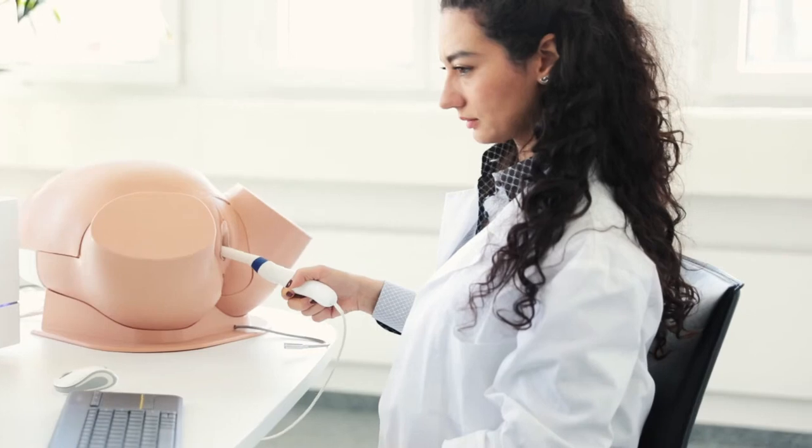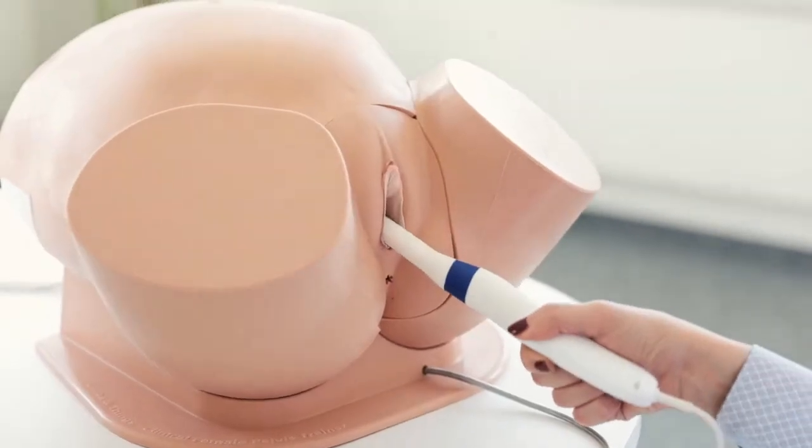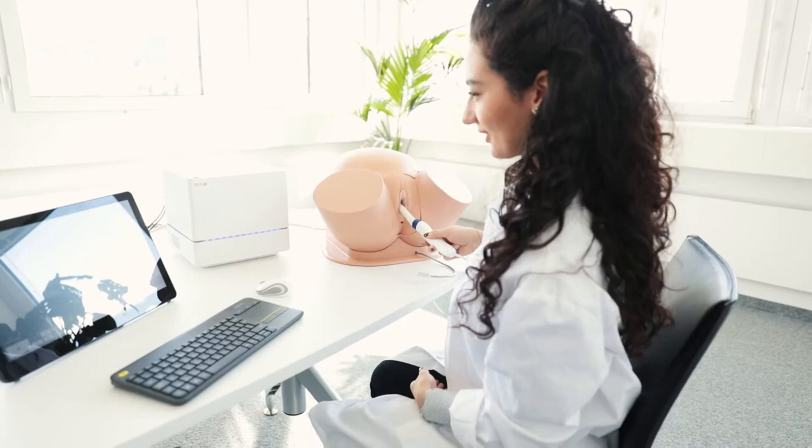I agree. It will be critical for the new learner who's never seen these cases, and maybe a while before they see them, and the case may be buried in the middle of a very busy day for them. So to have seen some findings on ultrasound for a rare case will be really critical. I see the use of this. We know that many of our allied health professionals do ultrasounds now, and so not only for the physician, but for all of our other allied health individuals who are also being used for doing ultrasounds, particularly in parts of the country where the care may not be as prevalent.